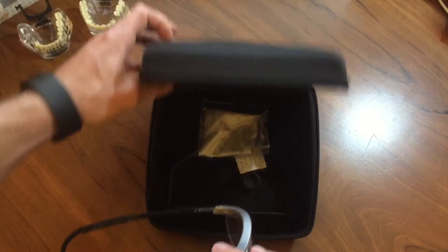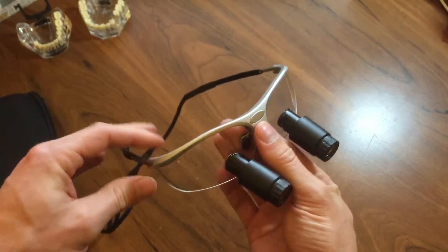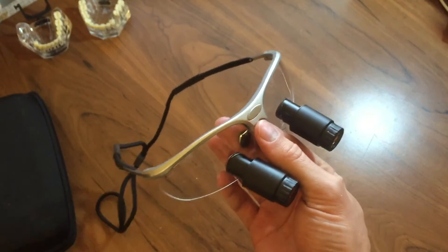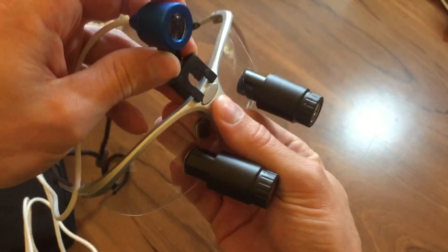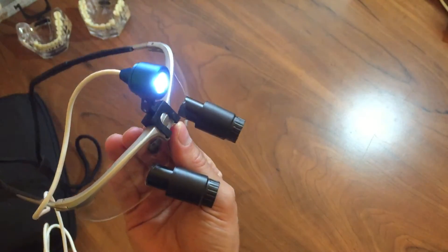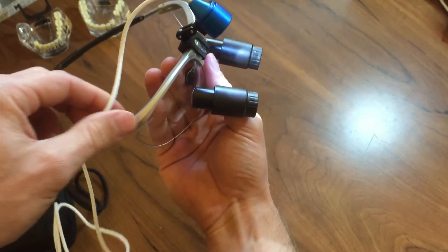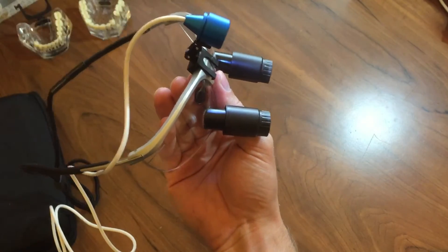So I pulled out a Typodont here. The other thing is, it did not come with a light, but that's okay. I have my own light from another set of loops and it fits on here no problem. I have no problems adjusting my light. Just about any light with any standard clip can clip on there, and that's no problem.